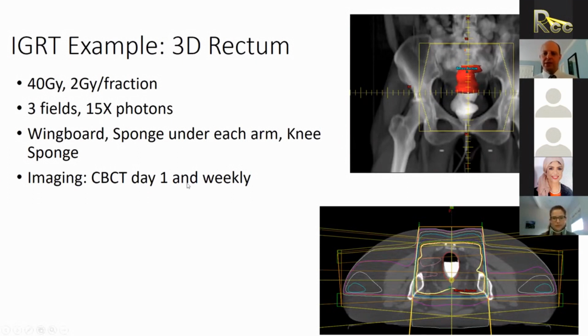Basically, verify the setup a little bit more thoroughly on the first day, and then set up the same each day, but then weekly kind of verify.